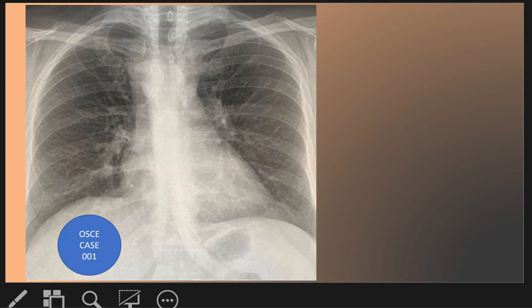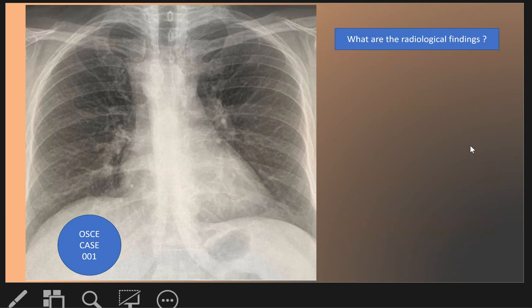This is a new session and we started with OSCE cases. This is the first OSCE case, as we see here in this chest X-ray. What are the radiological findings on this chest X-ray? Look at it and try to spot what the radiological findings are.